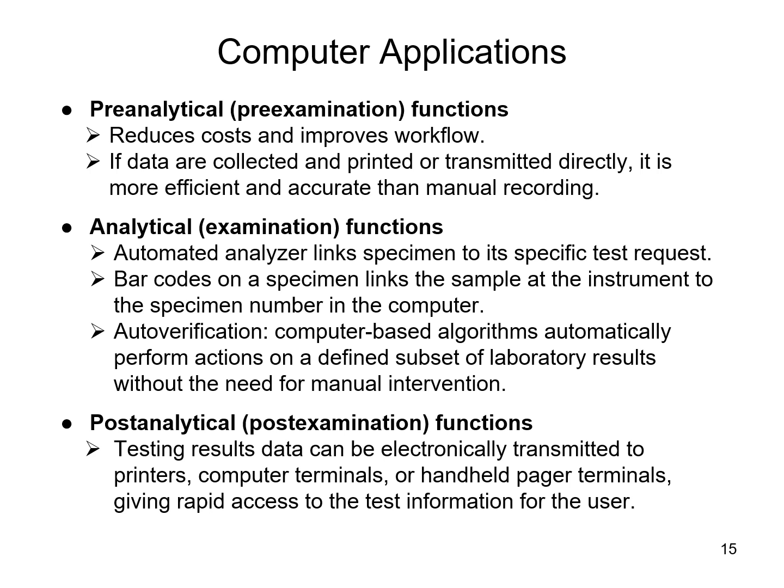And so this is called auto verification, where if the results are considered normal or just barely outside of normal, not critical, then you would go ahead and send those results out. The computer system would do it for you so that you don't have to worry about reviewing those results.